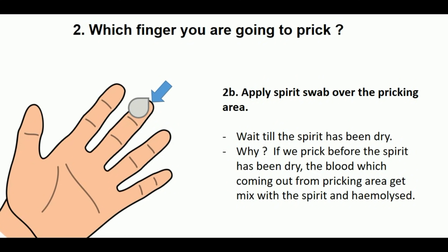Apply a spirit swab over the pricking area and wait until the spirit has dried. Why do we have to wait until the spirit has dried? If we prick before the spirit has dried, the blood coming out from the pricking area gets mixed with the spirit and becomes hemolyzed. So we need to wait until the spirit has dried.